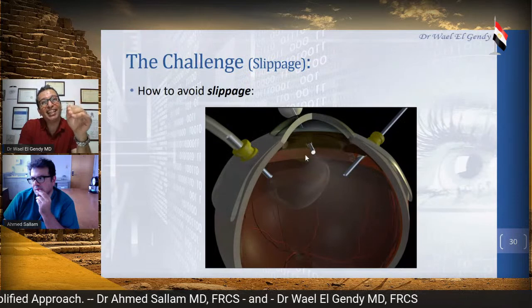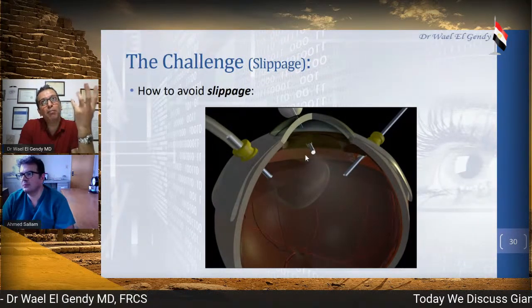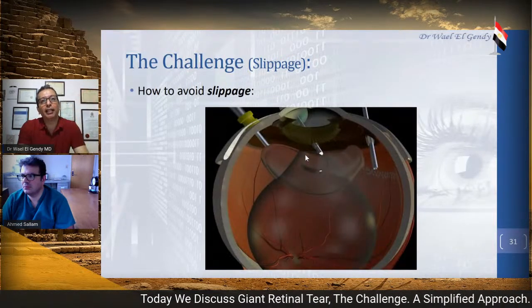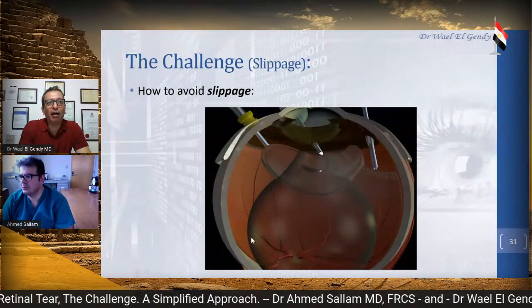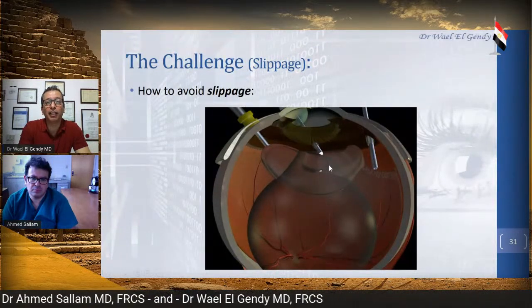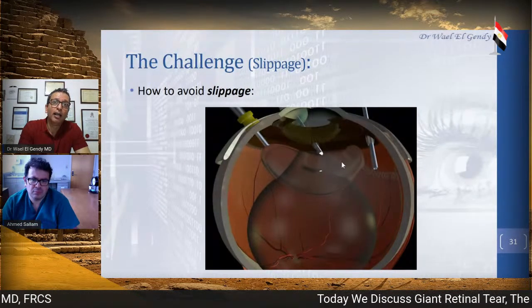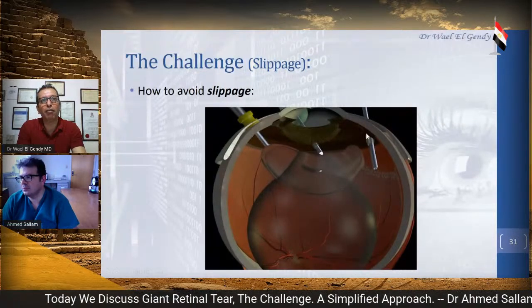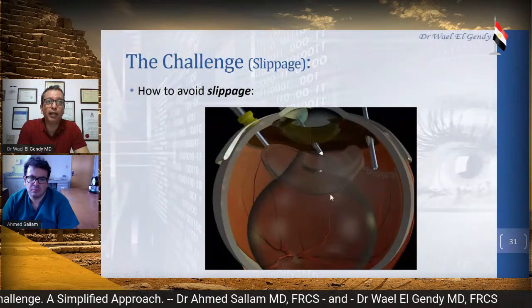So the PFC and the silicone don't form separate bubbles; they interact together. They fill in together. As you can see here, people expect to see PFC down and then fluid, and then because the oil is lighter, with a very light specific gravity, you would expect to see it floating above, but it doesn't. It actually collides together with the PFC.